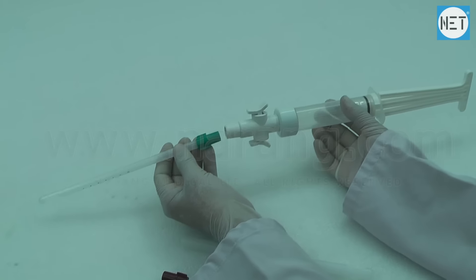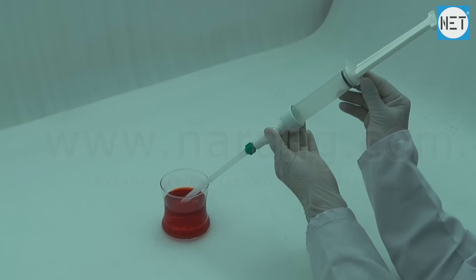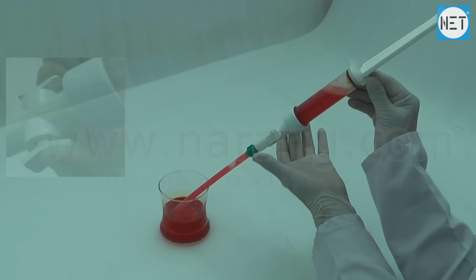This instrument can generate vacuum pressure identical to an electric suction generator until the aspirator is almost full. The Net aspirator is reusable.